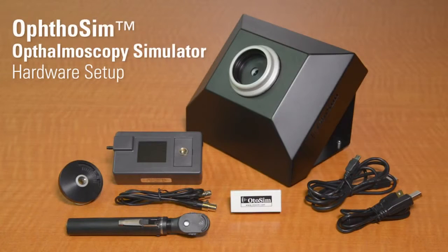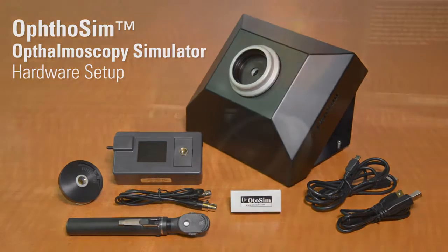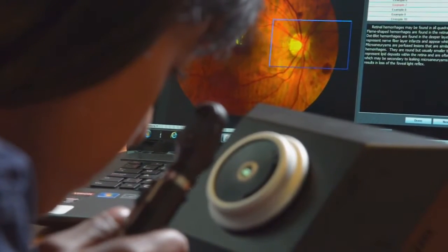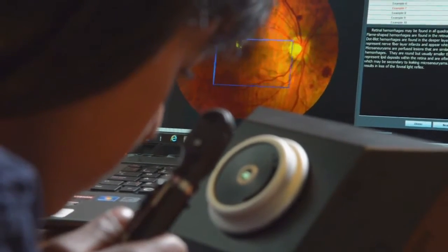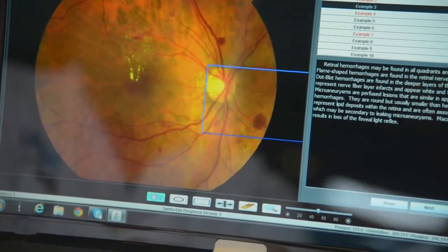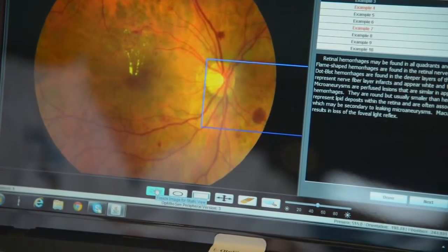In this video, we will demonstrate how to set up the hardware components of the OphthoSim. We recommend that you install the OphthoSim software before setting up the hardware. Please refer to the video segment on software installation for more details. However, you will require the fully connected hardware before you can access the OphthoSim software. Let's begin.